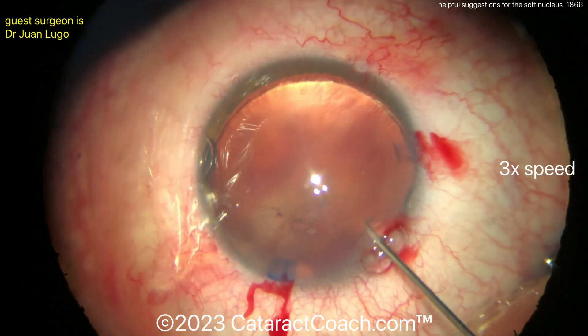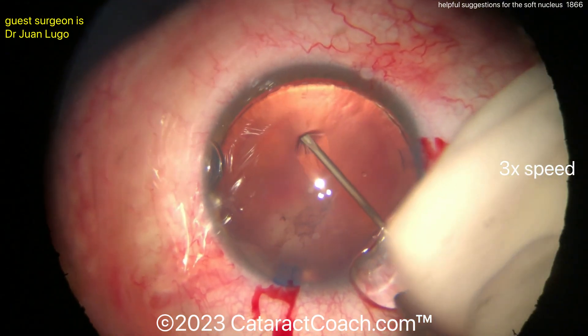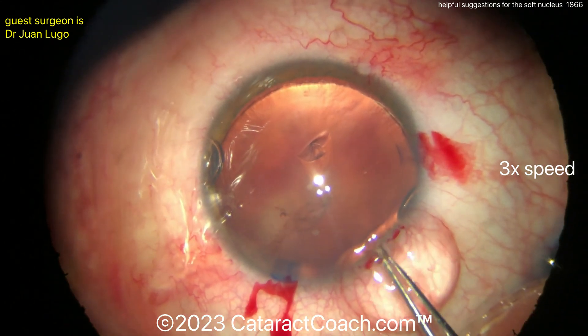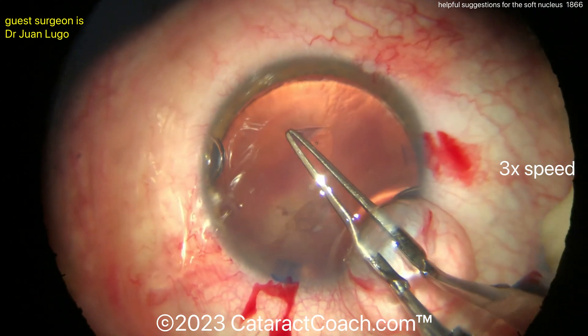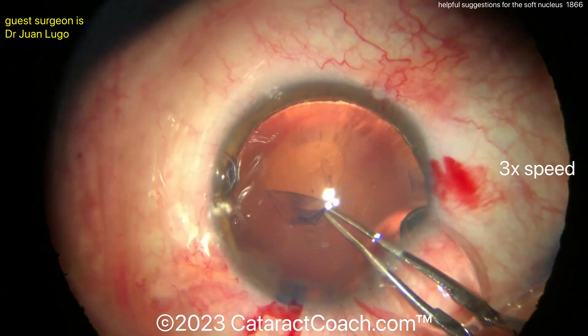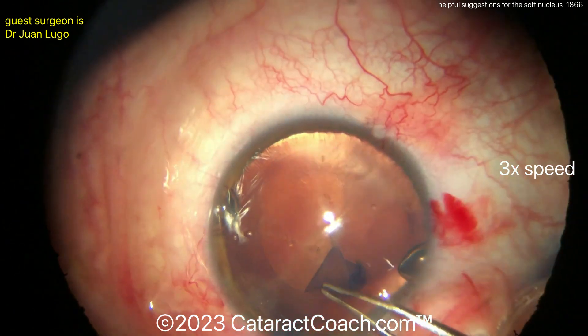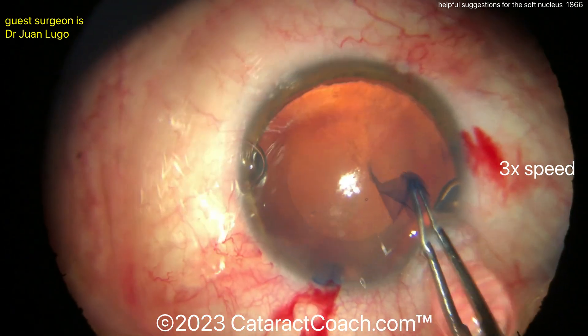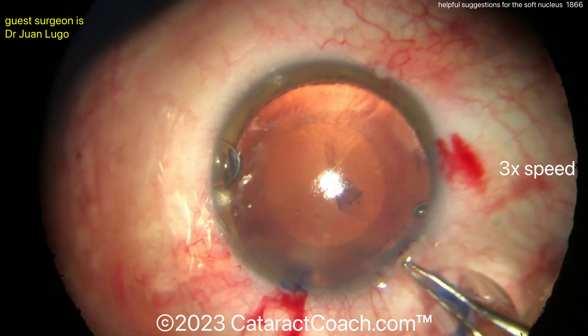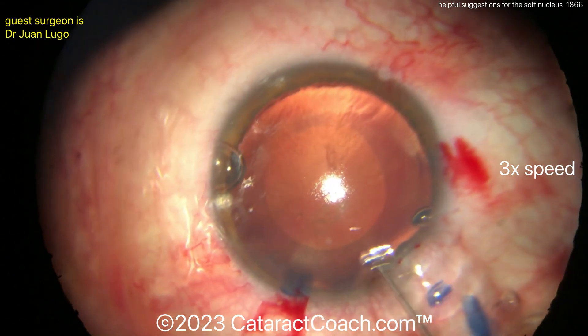So on a soft lens like this, my favorite technique is to prolapse it out of the capsule bag. To get it up at the iris plane — I think it's the easiest. You just get it away from the capsule bag. If it's a very soft lens, it's really difficult to actually split it in the capsule bag — difficult to chop it or do a stop-and-chop or divide-and-conquer. Those are all very difficult, so oftentimes the best technique is to do a prolapse.